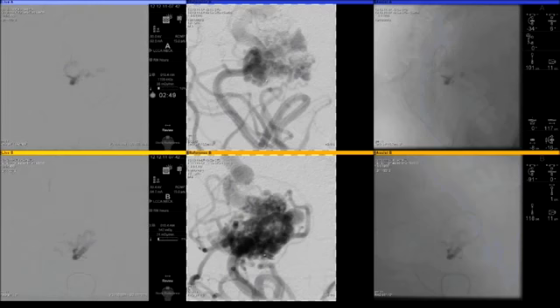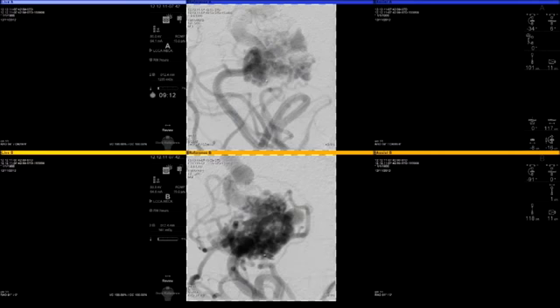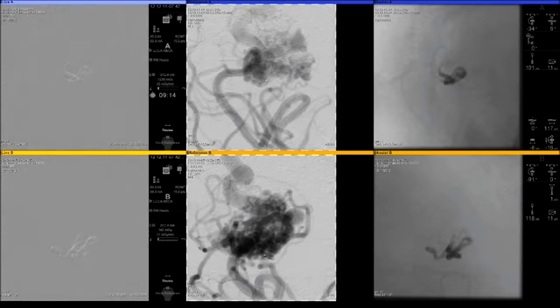So that traction is something that I avoid, at least until we have our detachable catheters available. I do like the navigation of this microcatheter, the Marathon, and it got us in a very good position. I have started using Onyx 18 in this AVM, and the preference here is because the flow of this AVM is not, in my view, a high flow AVM. This also allowed me to build, as you can see here, a very careful initial plug in the proximity of the microcatheter without having much reflux at this point.